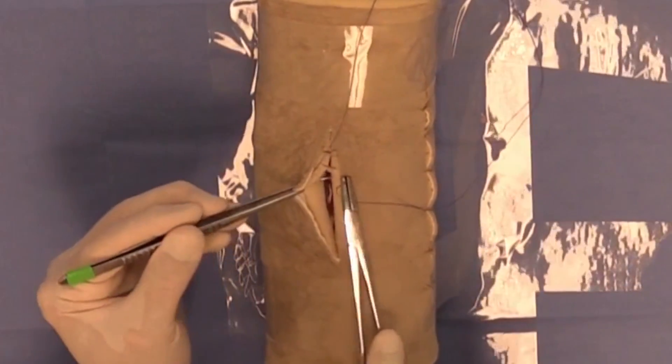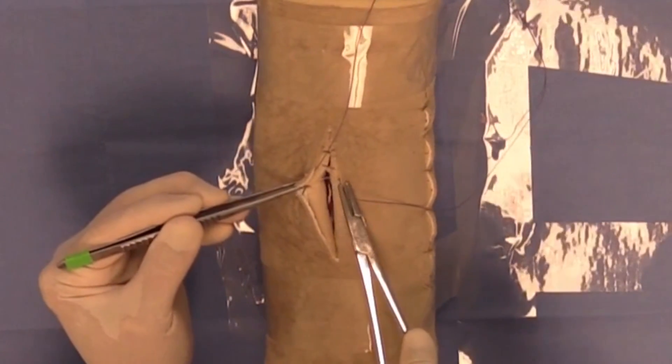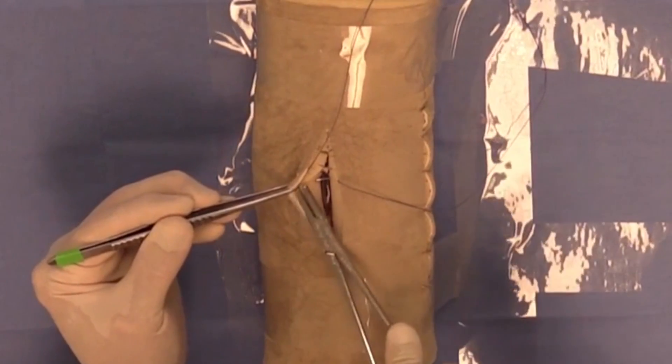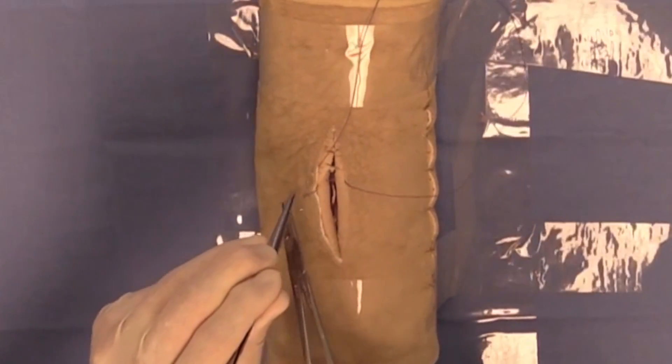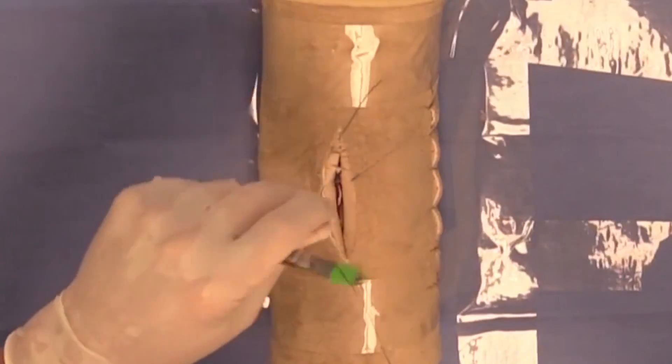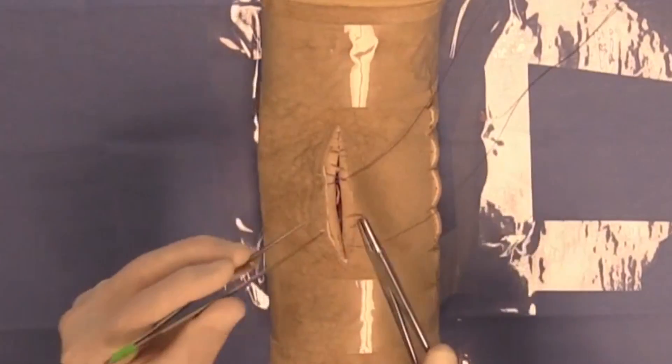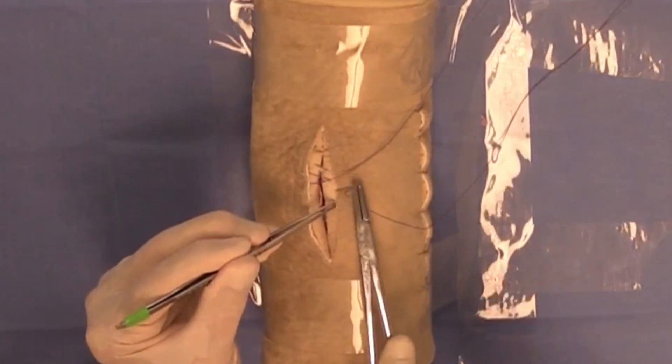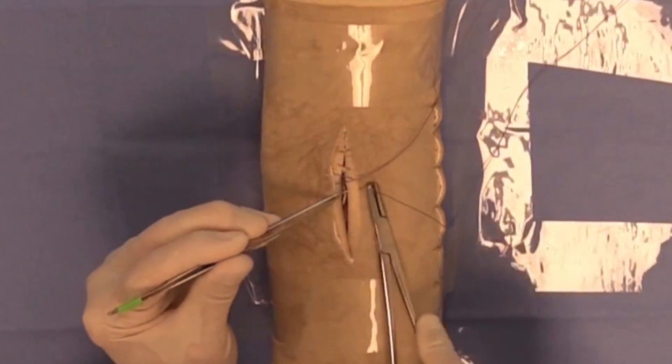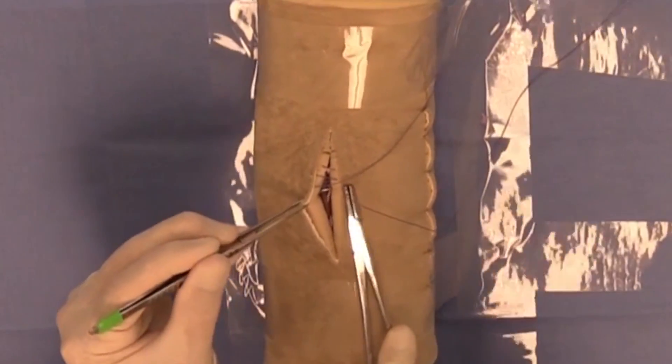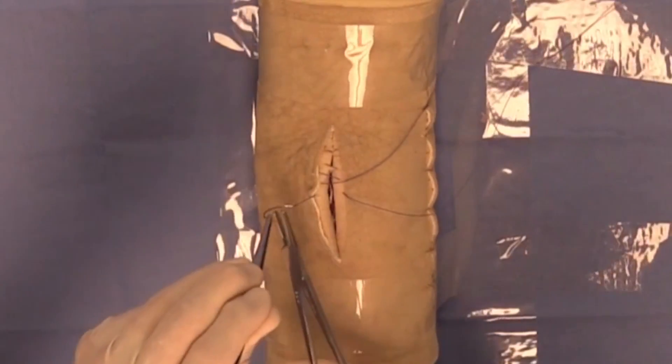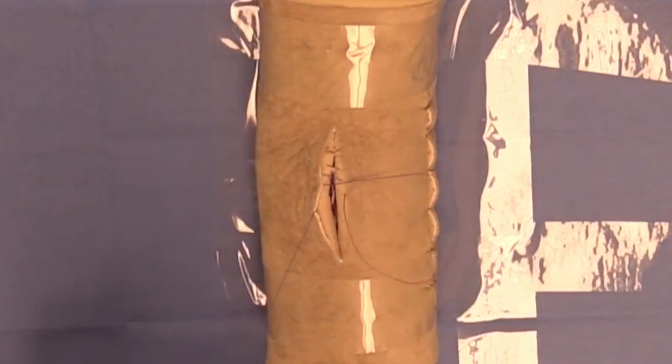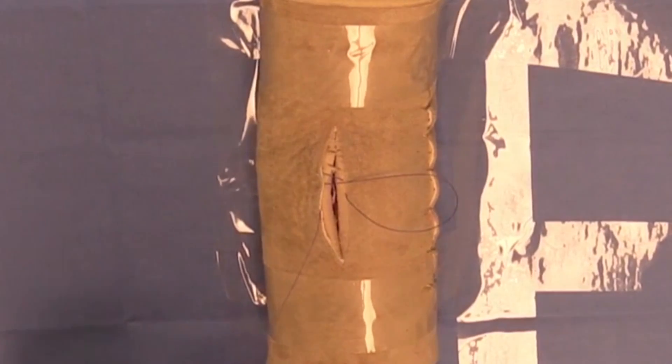It's a way of speeding things up a little bit by grasping, snapping your needle holder correctly in place and beginning your next suture bite. I found it necessary because of the gap in the DAISY to reset my needle midway and now I'm ready to tie.